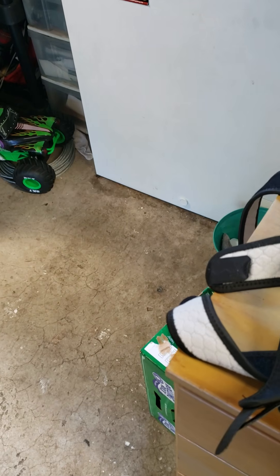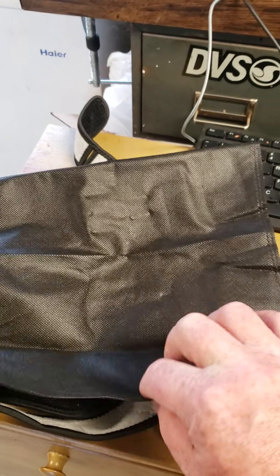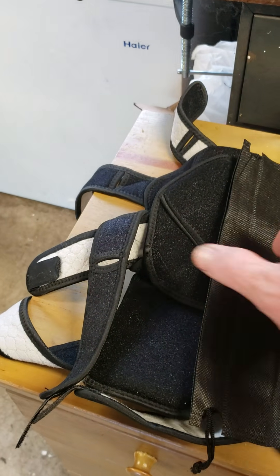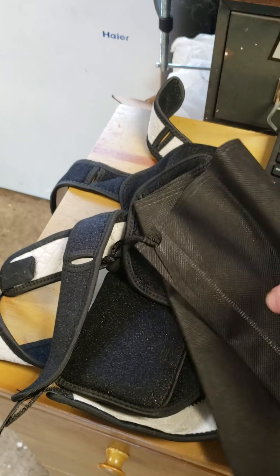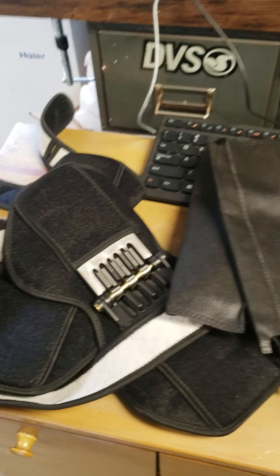You also get this nice bag here that you can put them in, which feels like a plastic vinyl kind of bag that will probably last maybe a couple of months. It's going right in the garbage can.